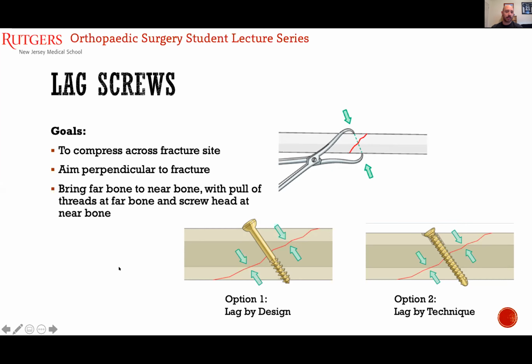And then just a reminder that when you're doing either lag by design or lag by technique, you want to have it perpendicular to the fracture site so you don't allow for any shear when you're compressing.